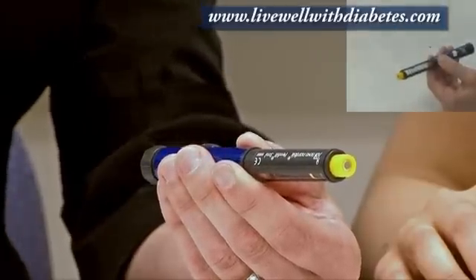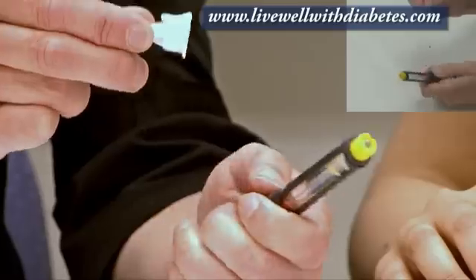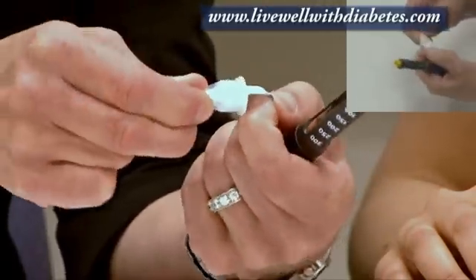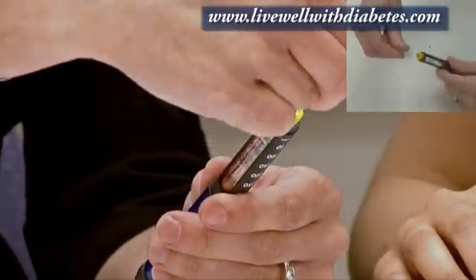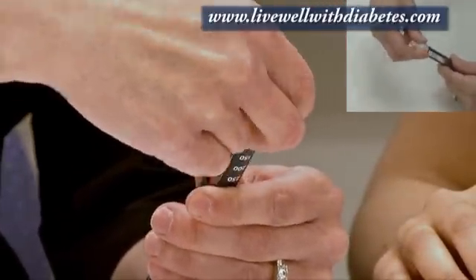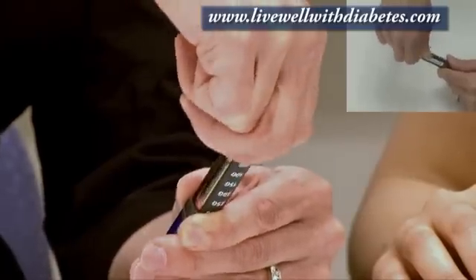The first thing you want to do is get a needle. Each needle comes with a piece of paper on it, and you pull the piece of paper off. This needle just fits over top of the pen — you push it over top first, and then you turn it firmly all the way on.